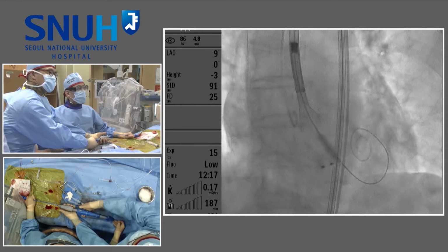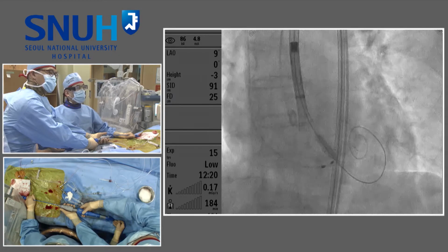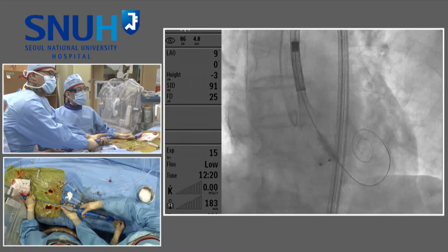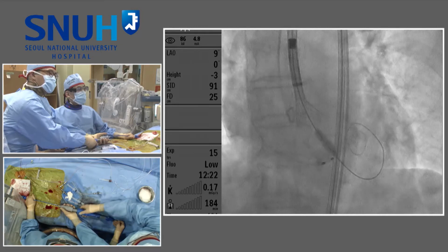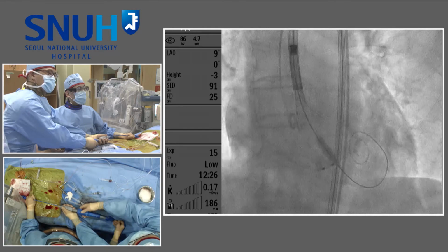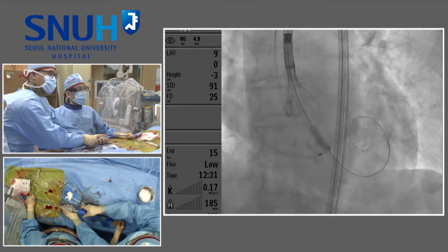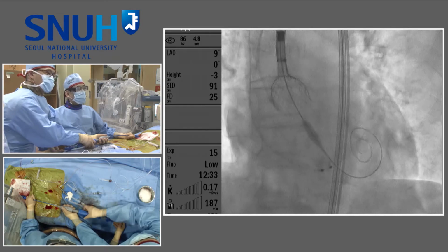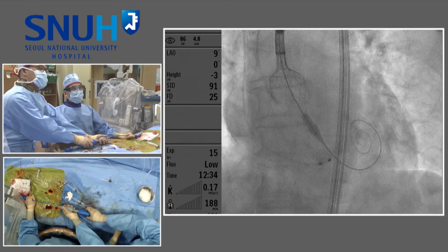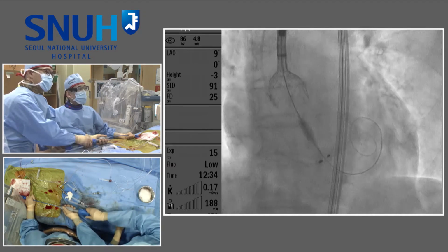Test it. Okay. Until now, the depth is good. Deploy. Yeah, also the tension of the wire is very important. Deploy. By the one operator, because he can control both, and he knows exactly how much he wants to push. Pop up. Pop up. Already. Yeah, capture. But you see the valve is so forgiving.